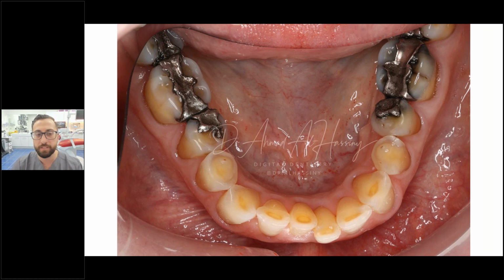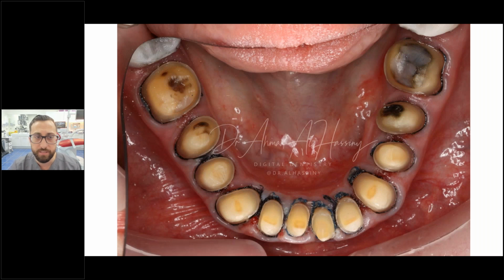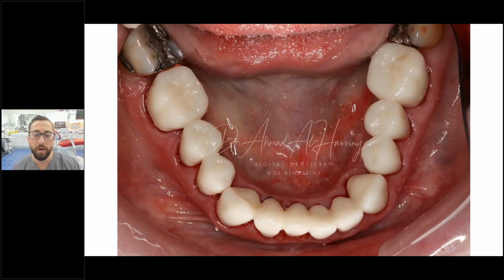And this is an example. This is a full mouth rehab case that I carried out a few months ago. You do your preparation, you scan this, and then you can print these restorations. And these restorations, in my mind, are infinitely better than any direct temporary, such as using Bizacryl or Luxatemp. These just beat direct temporaries in every way and form.